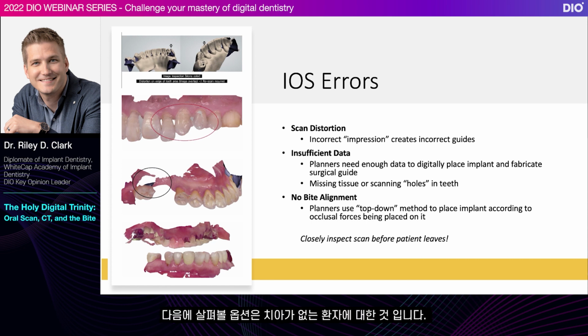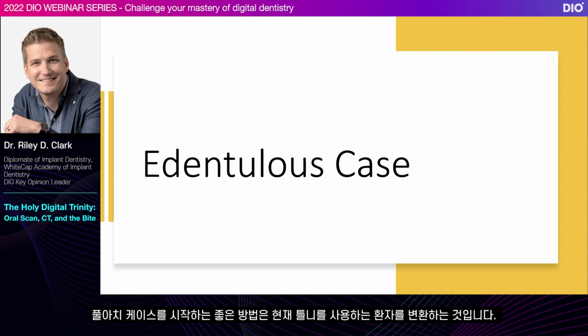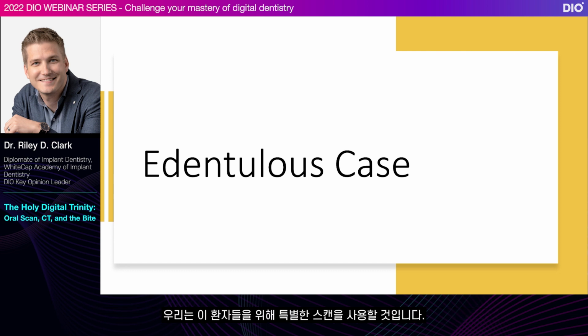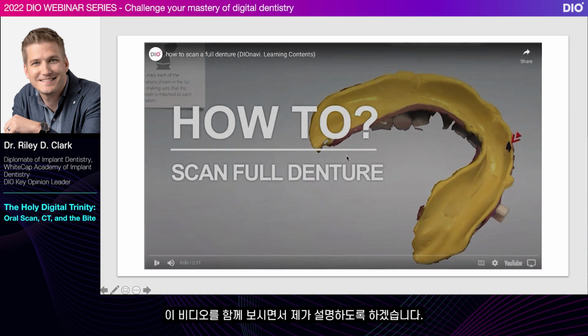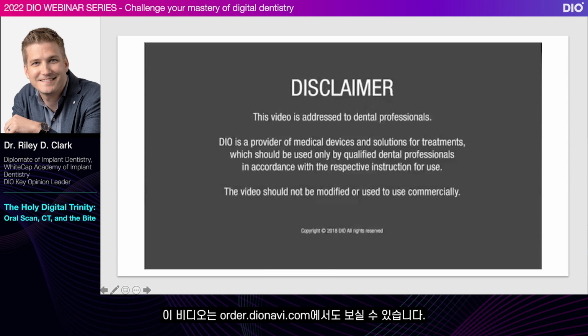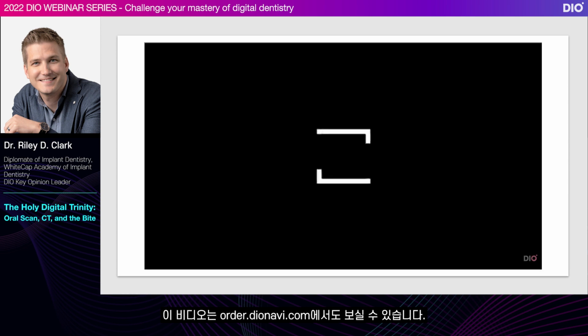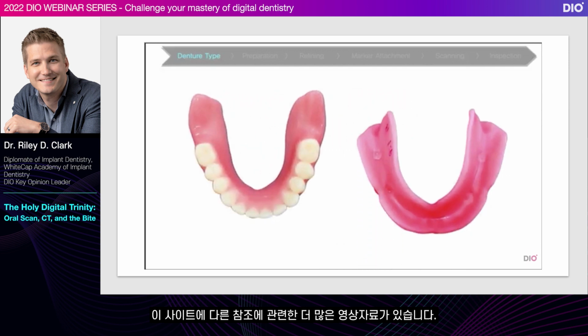The one other option I will talk about is the edentulous patient. Patients that are already edentulous, which I think is a great way to start with your full arch cases, is your current denture patients. We're going to use a special scan for these patients, and that is scanning their actual denture. I'd like to play this video and I'll narrate through it. This video can also be found on order.dionavi.com. There's more videos there that talk about different references.